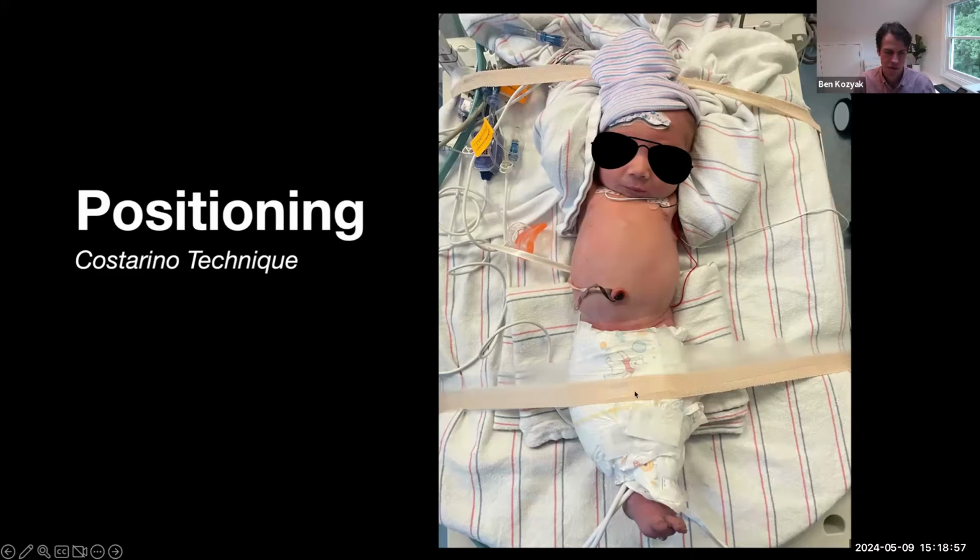So this is a pair of diapers connected in series, wrapped around the legs, and a piece of elastic tape over the knees, and connected to the bed. I find a bump under the hip does a lot to help the positioning of the hips, and it can help the catheter go where you need it to go. And then this is sort of a reverse swaddle, kind of laying on the beach pose to keep the arms out of the way.